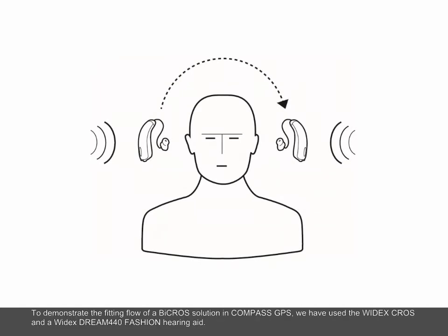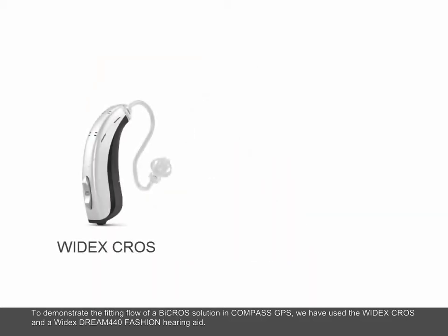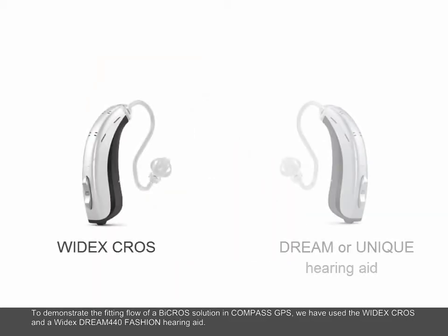To demonstrate the fitting flow of a bi-CROS solution in Compass GPS, we have used the Widex CROS and a Widex Dream 440 fashion hearing aid.